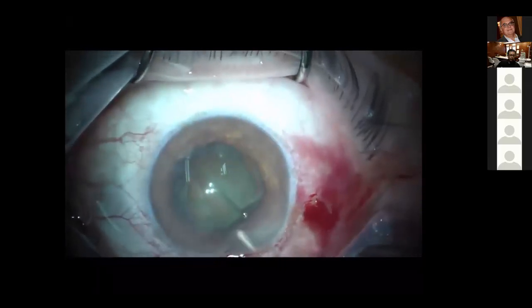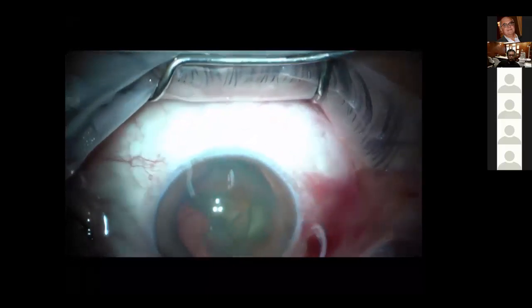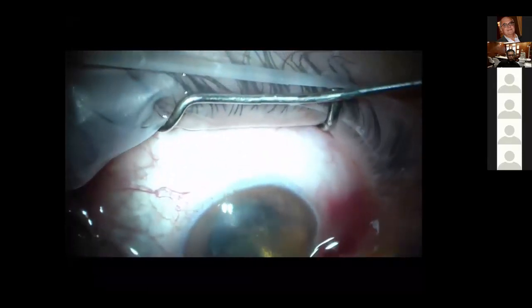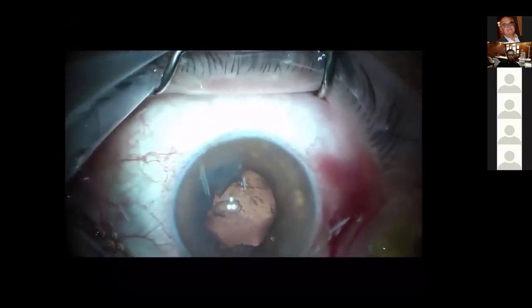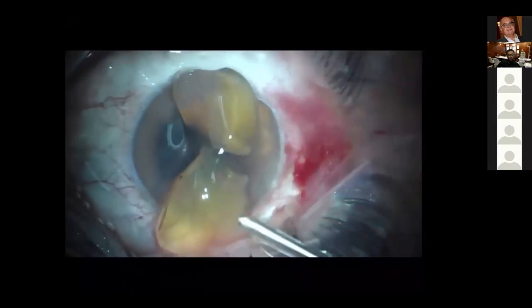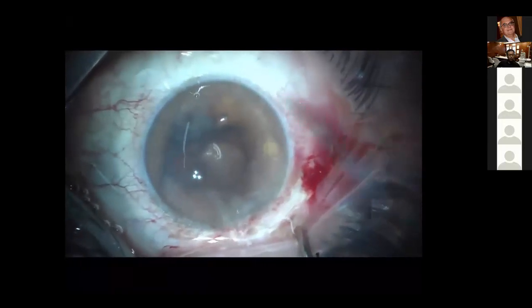You have to inject viscoelastic beneath the nucleus in order to raise the intraocular pressure to allow for the delivery of the lens fragment. And again, by visco expression, the rest of the nucleus can quite easily be expressed. And you successfully remove all of the nucleus fragments from within the eye. I'm showing here the nucleus fragments that has been removed. Once you get used to this technique, it's really quite simple and it's quite safe. And there is no phaco energy inside the eye.